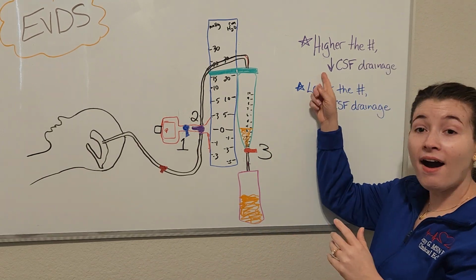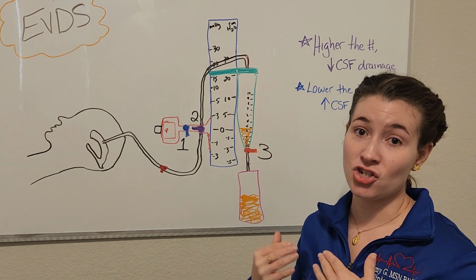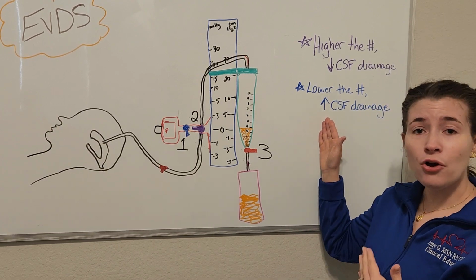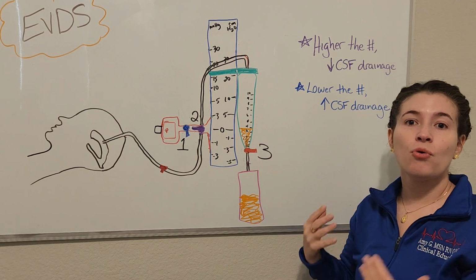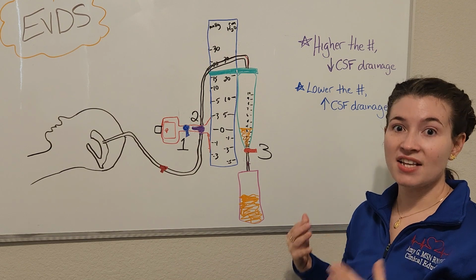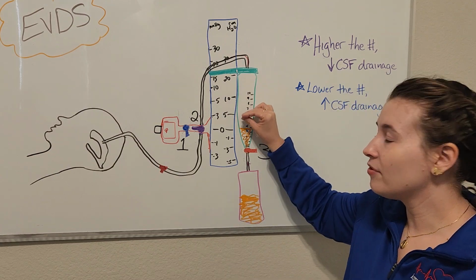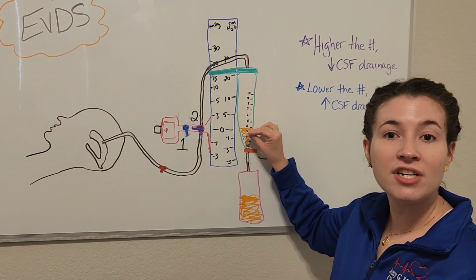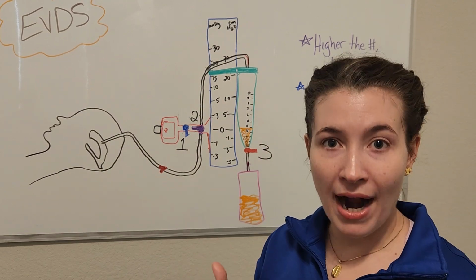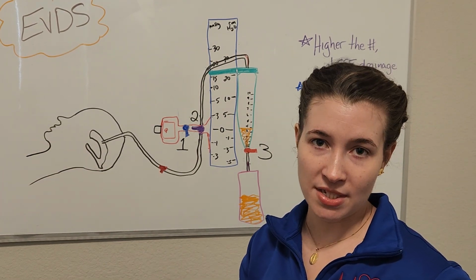So again, the higher the number that I have that drain set to, the less CSF drainage I'm expecting, and that typically means the patient is improving. The lower the number that I have it set to, the more drainage I would be expecting, and that typically means the patient still needs a lot of intervention to help get that pressure under control. It's not uncommon when we first place these to have orders to set the drain to 5, 0, sometimes even -5 in an attempt to drain off a rapid amount of CSF so that we can help get that pressure under control and reduce the risk of ischemia.